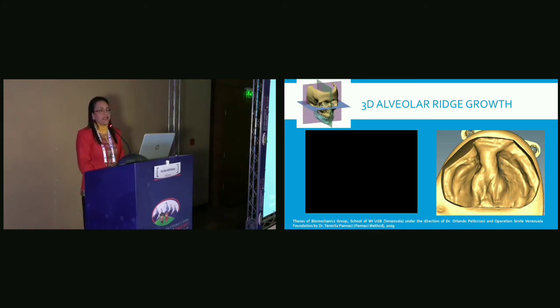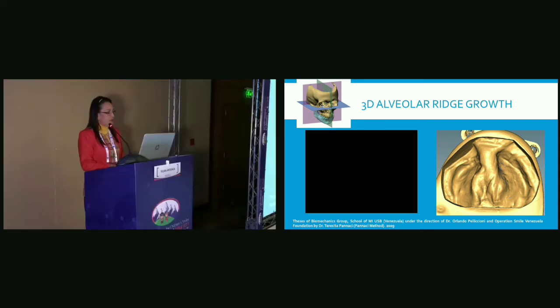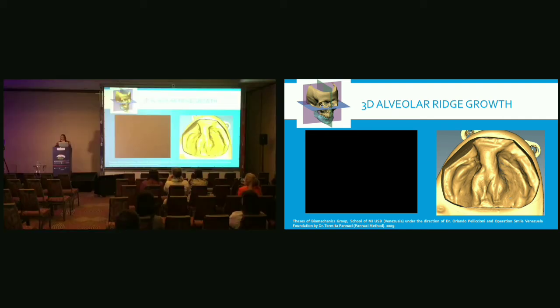So the other difference of this technique is that it works in the 3 dimensions of space. And I want you to see this video. We took some CAD-CAM images of this patient, so you can see how it's working in the 3-dimensional planes. You're going to see how at the beginning both segments were not aligned, and at the end, after the gingivoperiosteoplasty, they are completely aligned. Let's see.